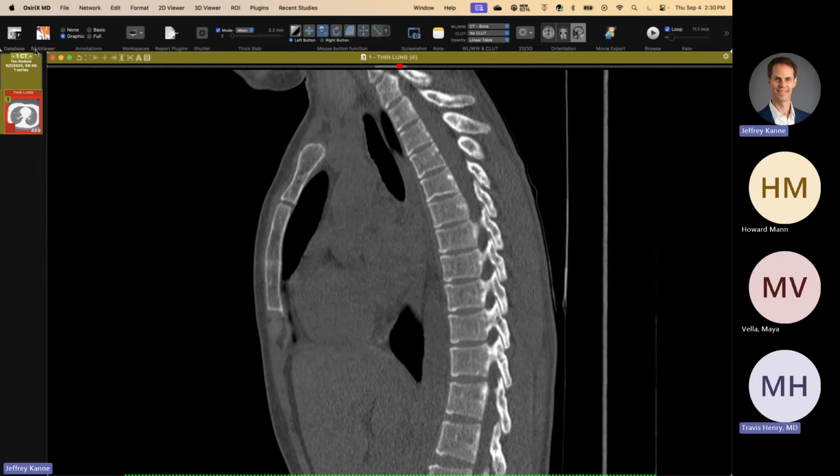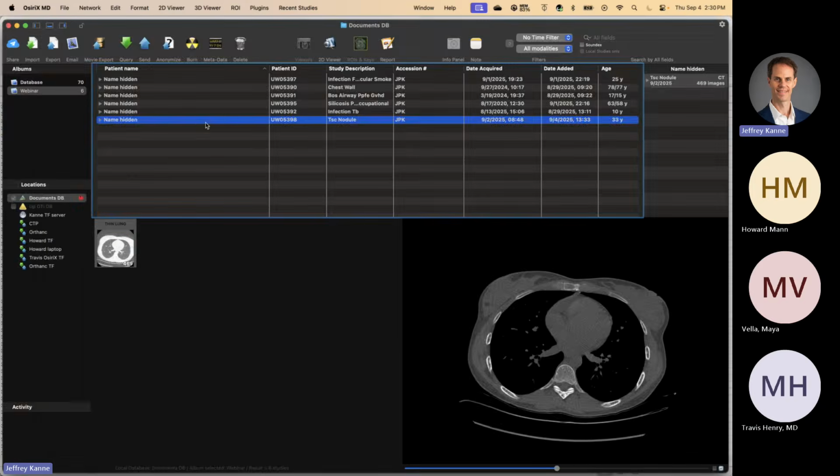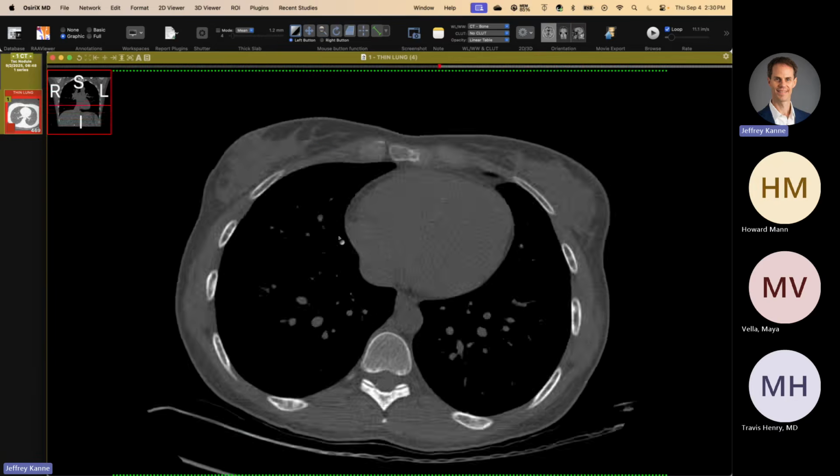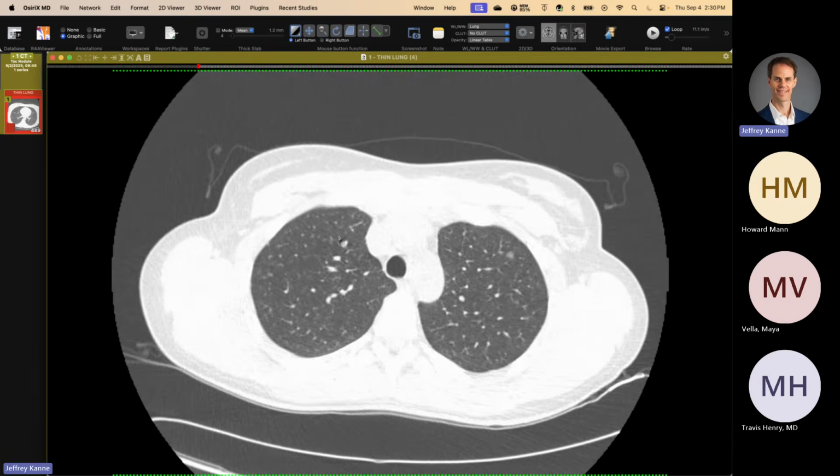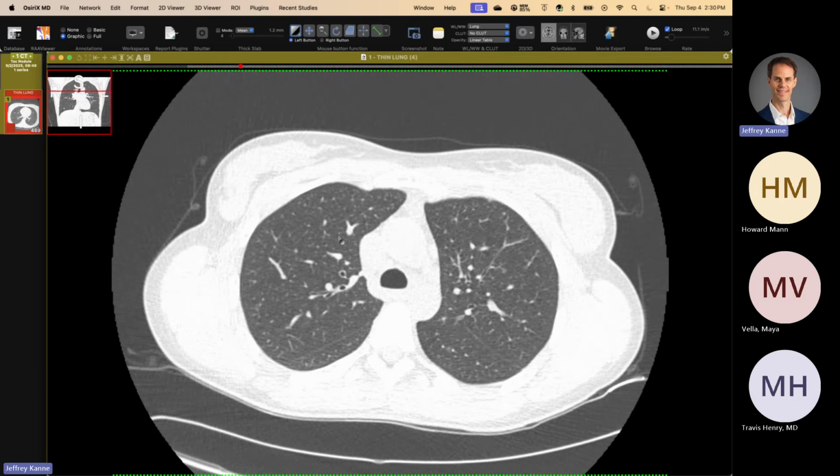So I confirmed she has tuberous sclerosis, and this is presumably multifocal micronodular pneumocyte hyperplasia. She does not have LAM. I didn't see anything to point to LAM. I looked for fat in her myocardium, but the osteopoikilosis and a bunch of kidney masses fit with tuberous sclerosis. So yeah, I've only seen a few of these cases. People describe ground glass with LAM. I suspect that's what it is, but we just don't see it very often. And I've only seen it with tuberous sclerosis associated LAM. But this one is the first time I've seen it without the LAM.